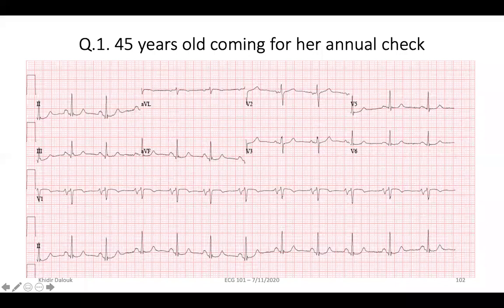Okay, I think I see a question. ECG can be very subjective. To what extent should I depend on it? I'm not sure what you're referring to by being subjective. I think we have criteria and you have a lot of things. Maybe there is some subjectivity, for example, if I say this P wave is 2.5 boxes and you say it is 3.5 rather than 2. But in electrophysiology, we use calipers. Electrophysiology works in milliseconds. We're very discrete about what we describe. So there might be some subjectivity, but overall it's a very objective tool from which you can most often reach a diagnosis.